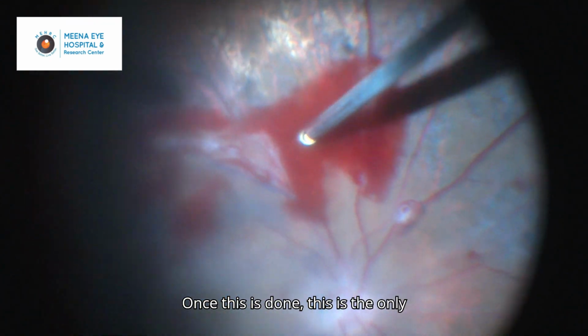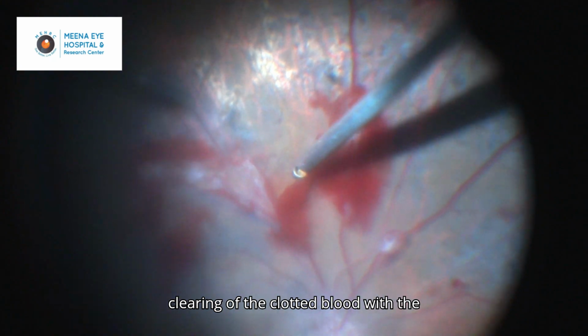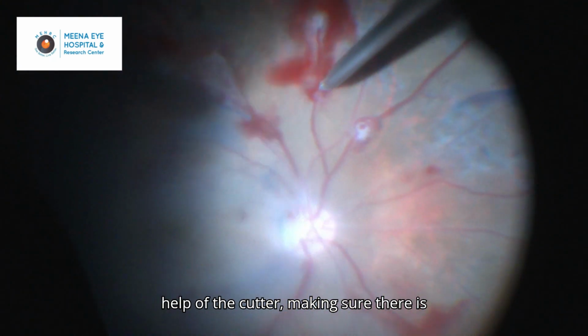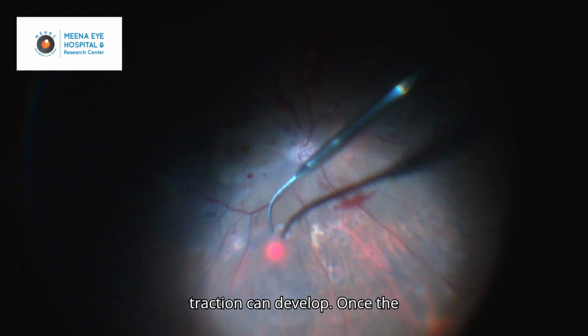Once this is done, this is the only problem area now left to deal with. So clearing of the clotted blood with the help of the cutter, making sure there is no 2-point attachment of the vitreous or any membranes, so that no future traction can develop.